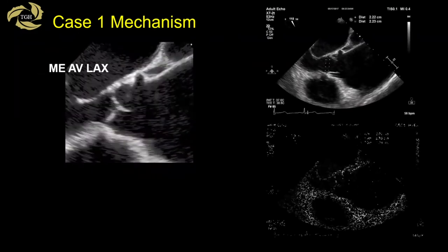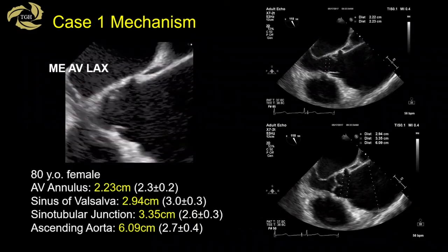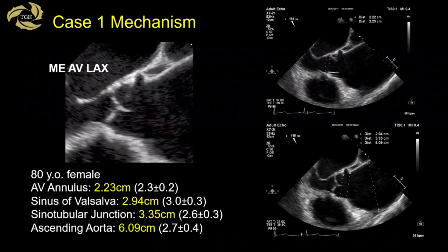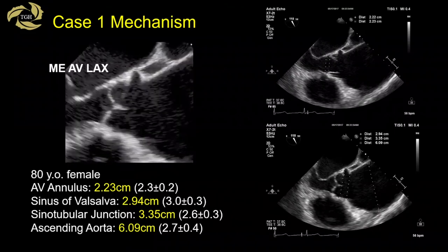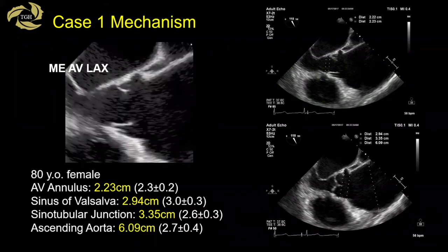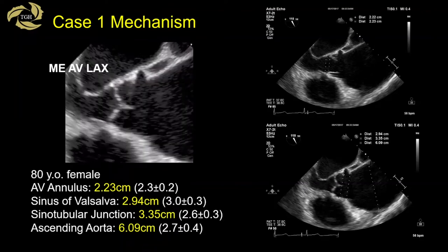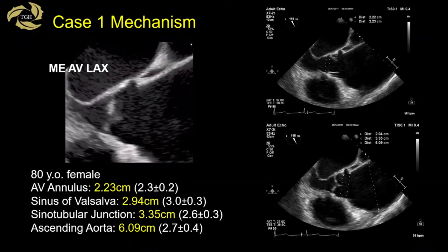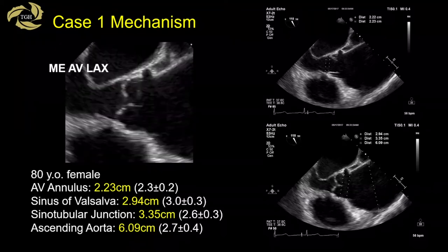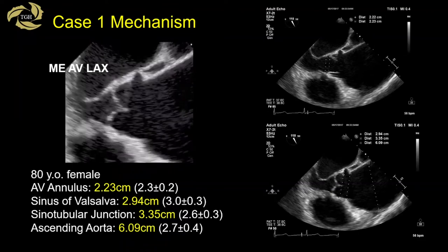In this 80-year-old female, measurements are: annulus 2.2 cm, sinus 2.9 cm, sinotubular junction 3.3 cm, and ascending aorta 6.09 cm. The pathology relates to both the sinotubular junction and the ascending aorta — that is why this patient has AI. If the sinotubular junction were spared, it is very common for these patients to have no AI at all, with just aortic root or ascending aorta dilatation.